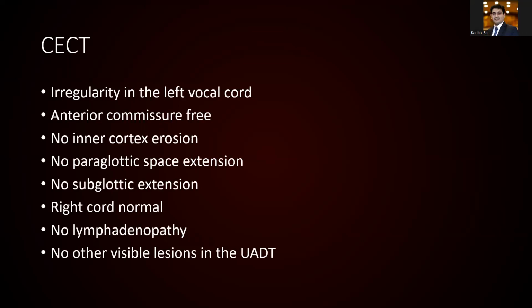Ma'am, in CT scan, number one, the acquisition time can be done within minutes. Second, CT scan can give us thin cuts, all the way down to 1 to 2 millimeters. A thin slice CT can be done. Next one, dynamicity. We can do dynamic procedures while doing a CT scan. We can take CT cuts while the patient is saying certain words like E, when the patient is deep breathing, or even when the patient is doing Valsalva.